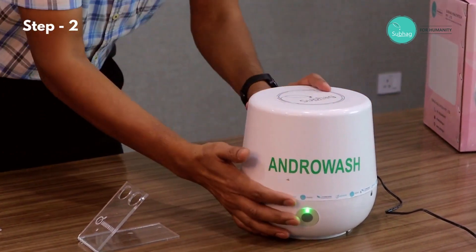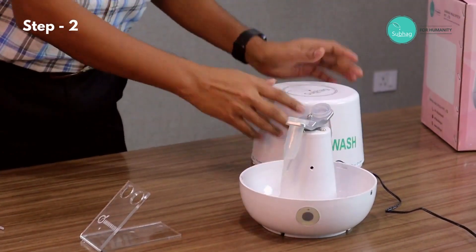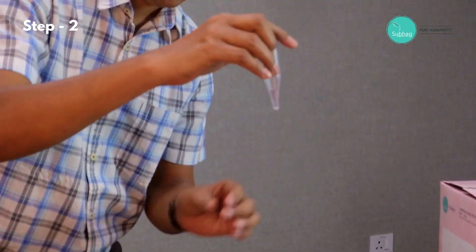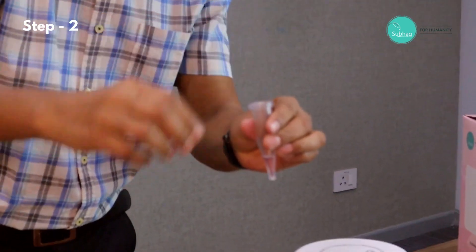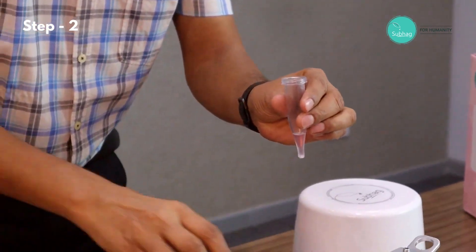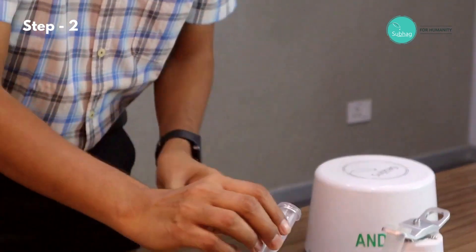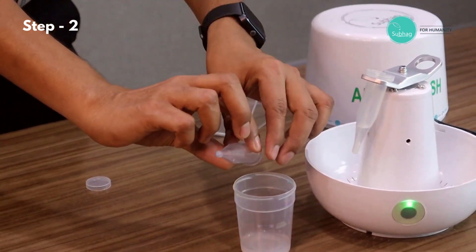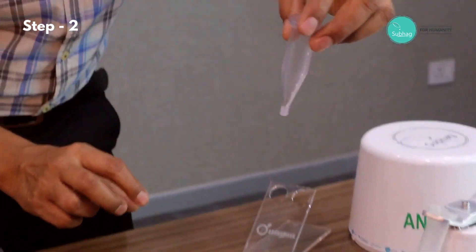We remove the cap and take the tube with the semen sample. Now we simply discard the supernatant by tilting the tube, and we discard it.